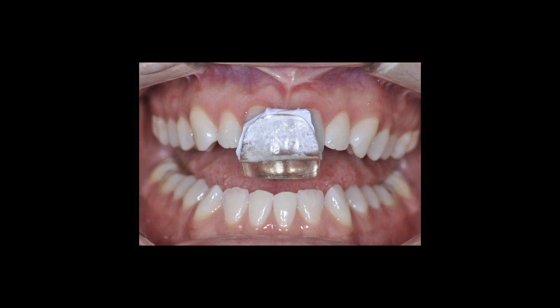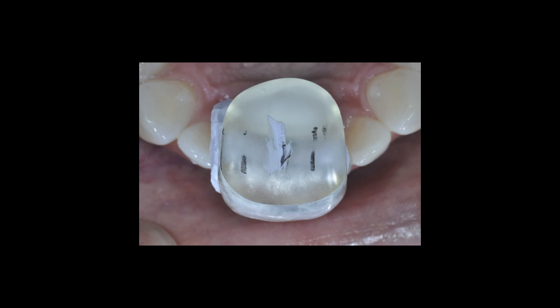You can see here we've tried it back in with all of the excess trimmed off. The next thing is to check the patient's occlusion and make sure that we do have even guidance on right and left of the midline as well as a smooth protrusive stroke. I hope this has been helpful in fabricating a Lucia jig.